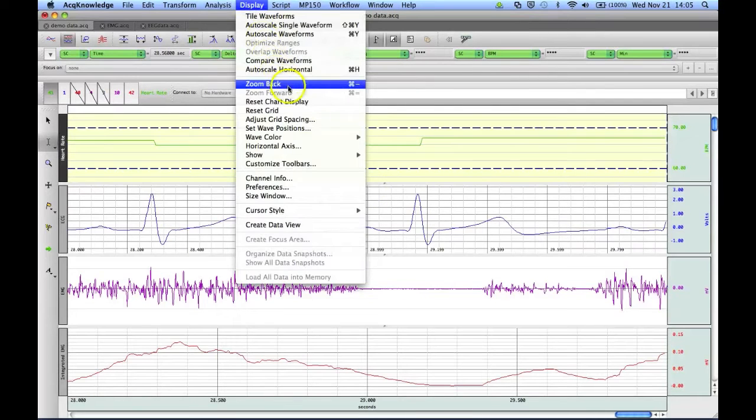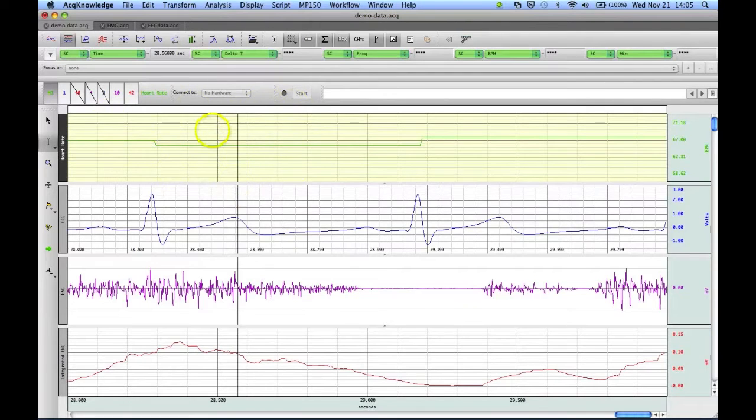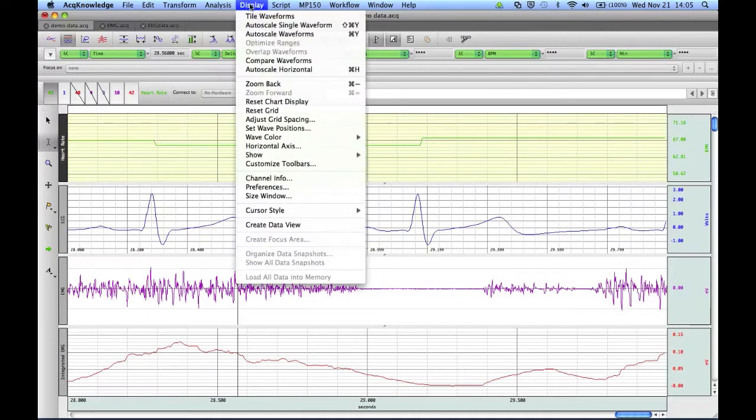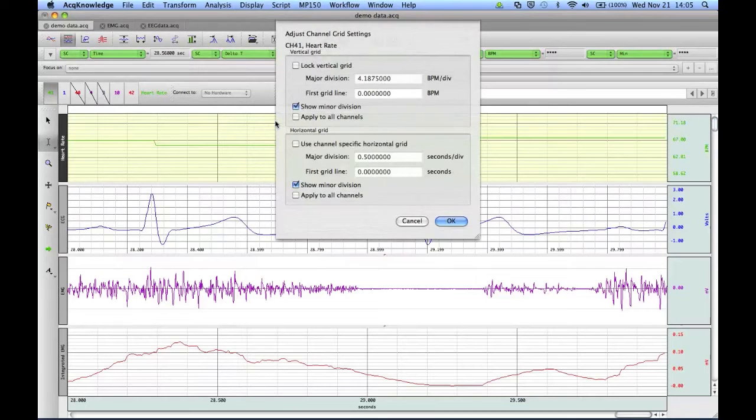You can also access some of the grid settings from the Display menu, such as Resetting Your Grids. This removed my custom grid from the heart rate channel, as it was the selected channel, and you can go back in to your Adjust Grid Spacing menu options.